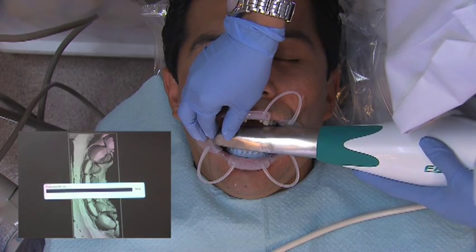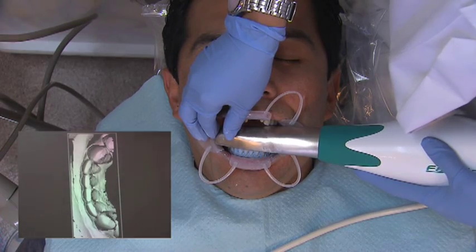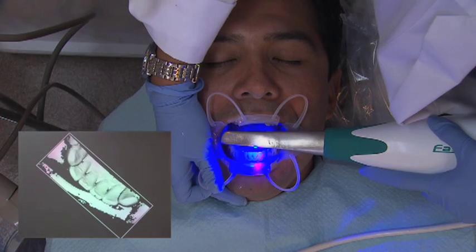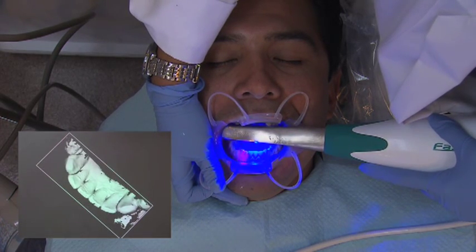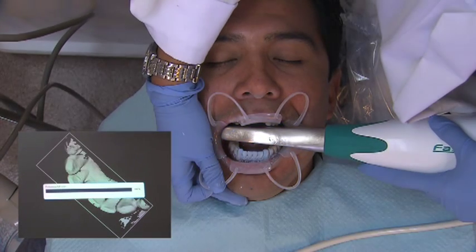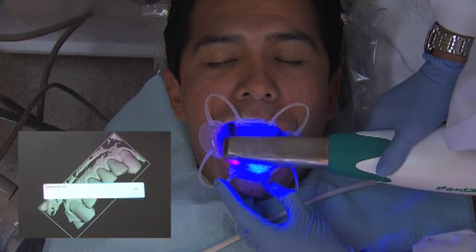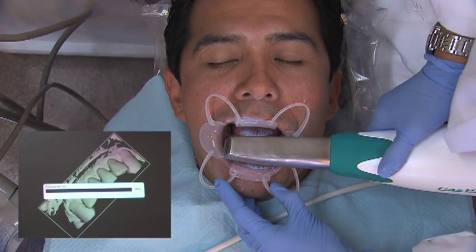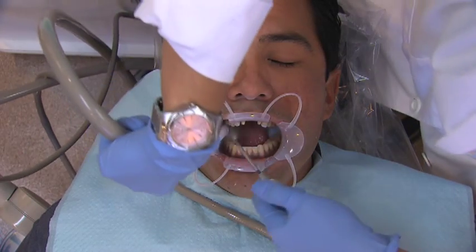You could probably do just two of them — the incisal and the facial — if you wanted to. But again, when you work with technicians, you get used to wanting to provide them the most information possible, because you definitely see an increase in the quality of work that comes back. The better information you send out, the more likely you are to get a crown that not only fits, but looks good and has proper morphology.